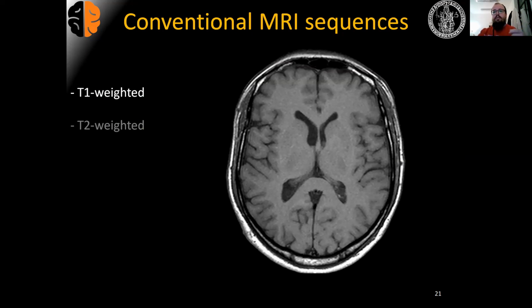There is a rule that we teach young neuroradiologists to understand which kind of images we are working on. T1 weighted images follow the rule of gray is gray and white is white, which means that gray matter, so the cortex, has a grayer, kind of hypointense signal compared to the white matter, which appears brighter, so it appears white.